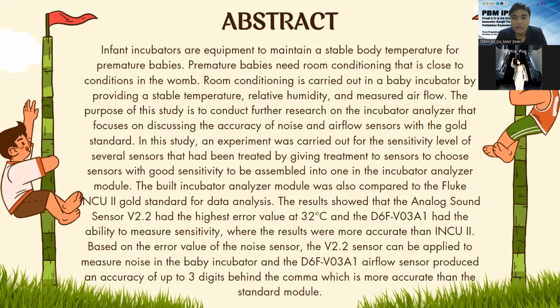The results showed that the analog sound sensor V2.2 had the highest error value at 32 degrees Celsius, and the D6F-V03A1 had the ability to measure sensitivity, where the results were more accurate than the INCU II. Based on the error value on the noise sensor, the V2.2 sensor can be applied to measure noise in the baby incubator, and the D6F-V03A1 airflow sensor produces an accuracy of up to 3 digits behind the comma, which is more accurate than the standard module.